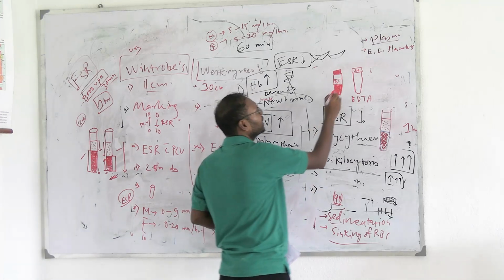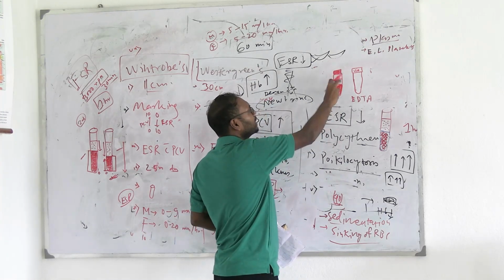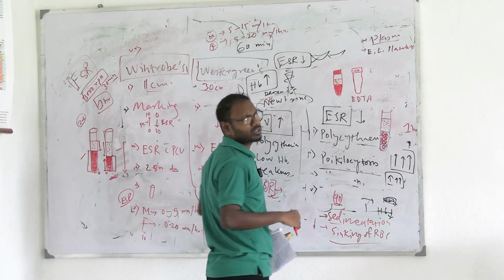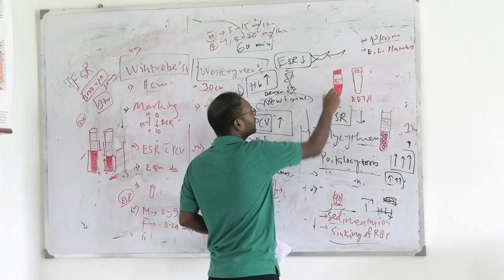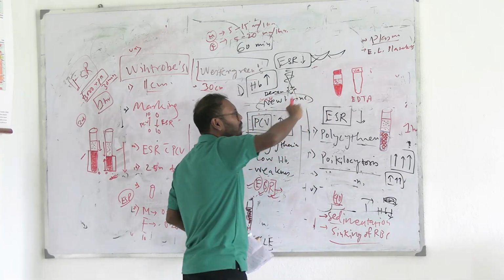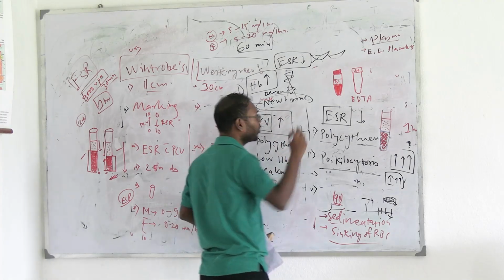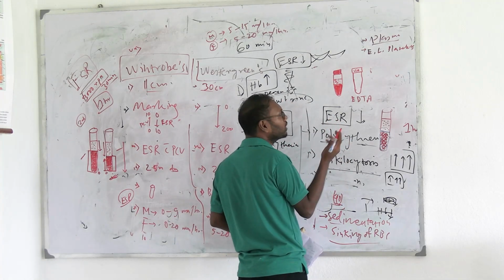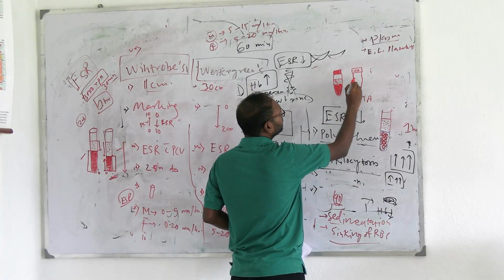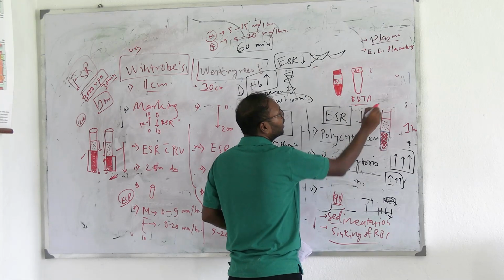So now if you consider a red top tube, can you measure? No, because these things have already been agglutinated. So তুমি এটাকে ইউজ করতে পারবে না। These cells have actually gone through agglutination and are clumped to each other, so you cannot measure them separately. So to keep the blood in good condition, to prevent clumping and coagulation, you will have to use these anticoagulant tubes.